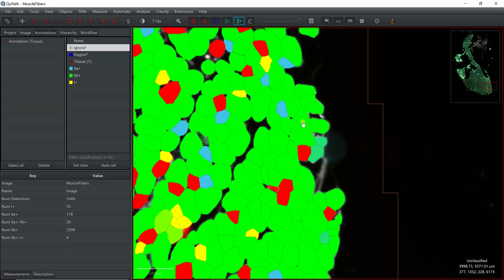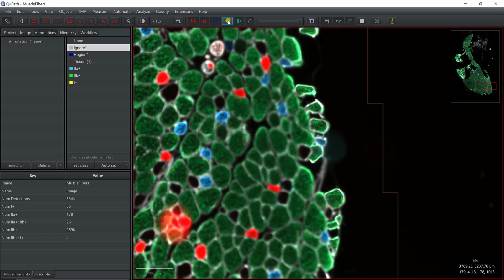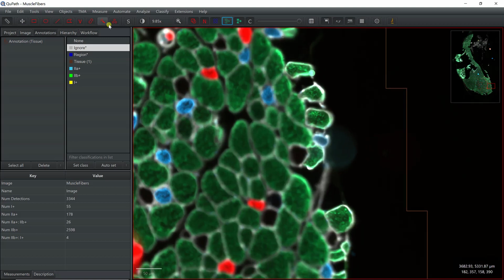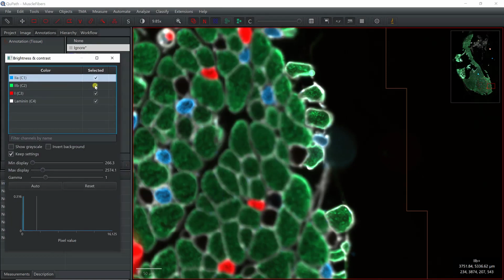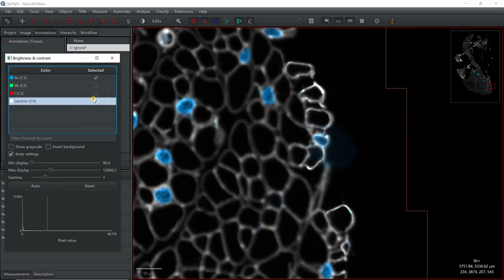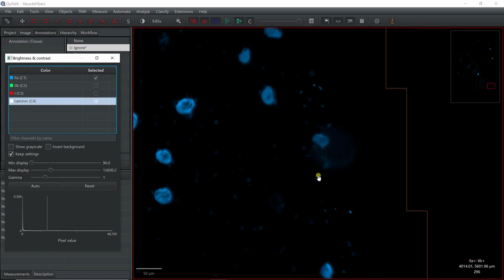It's probably because it saturates. So here probably because the blue is high, I don't know, maybe we have a little bit of it in the other. Yeah, here it's because of this bubble actually. So I should have better trained my classifier, because here clearly this is positive and shouldn't be positive.